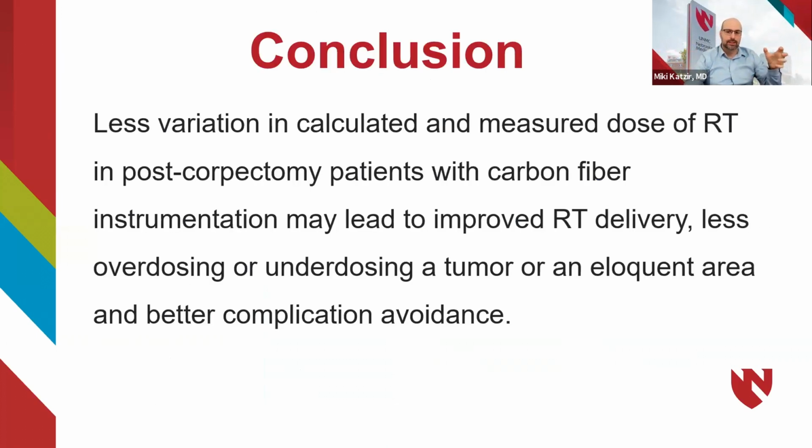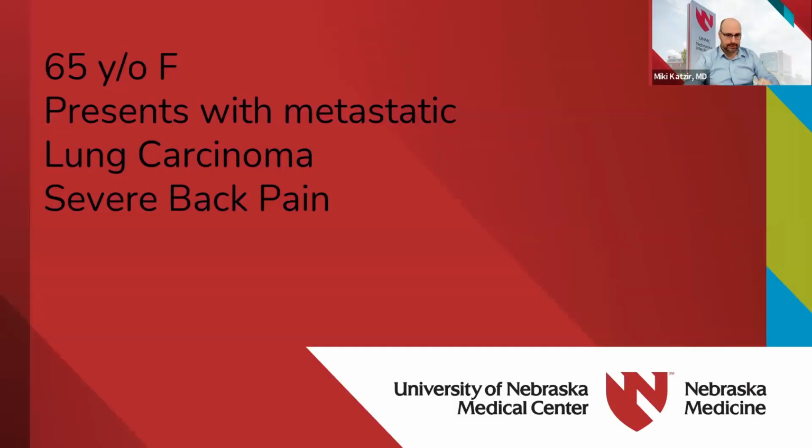So less variation in calculated and measured dosing of radiotherapy in post-corpectomy patients with carbon fiber instrumentation may lead to improved radiotherapy delivery, less overdosing or underdosing of a tumor or an eloquent area, and better complication avoidance.